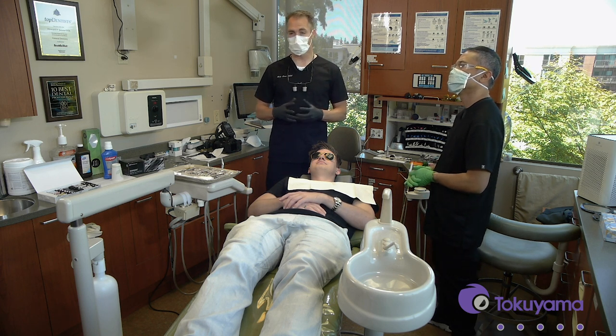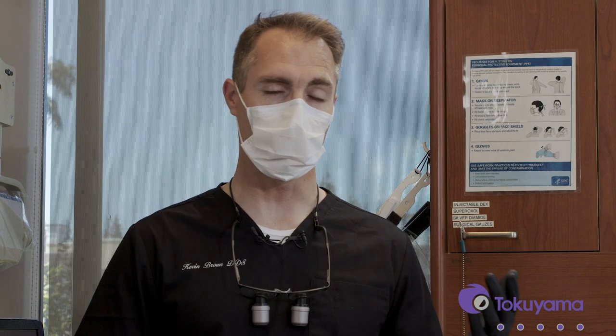For the patient, it's always a perfect color match — you don't have to worry about not getting it just right, and the patients are very happy about that. Especially when they know they can whiten their teeth afterwards, or if their tooth happens to change color a little bit over time, this composite is going to match both scenarios. So it's really just a new generation setting a new bar for composites — it's really an awesome material.